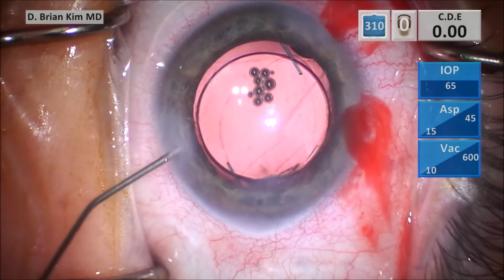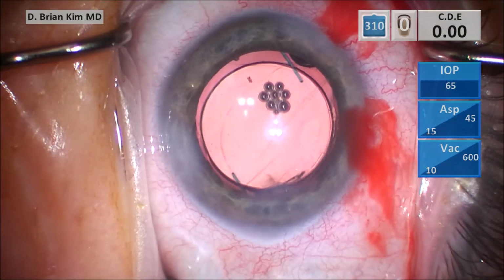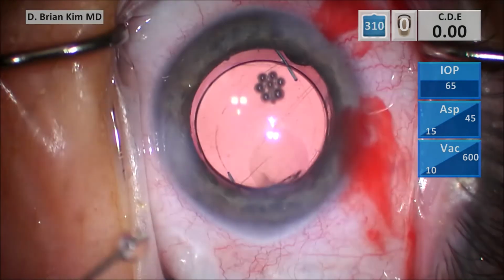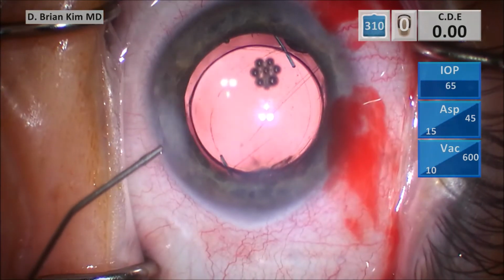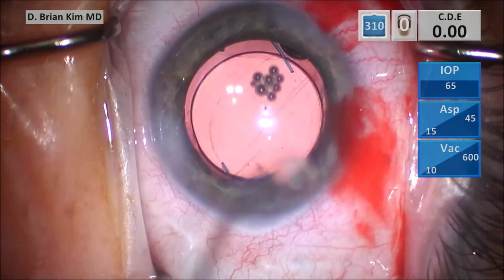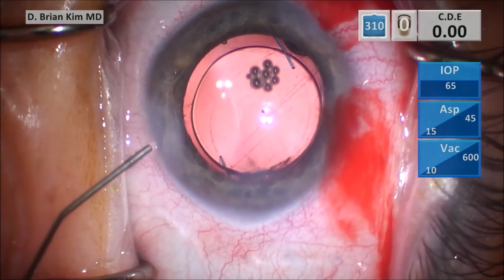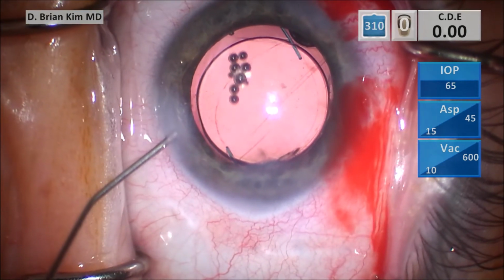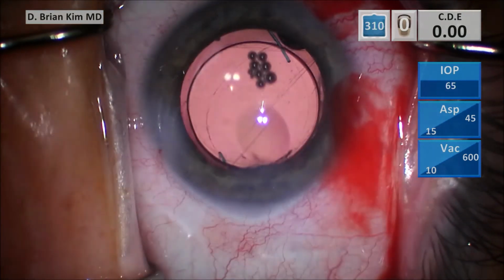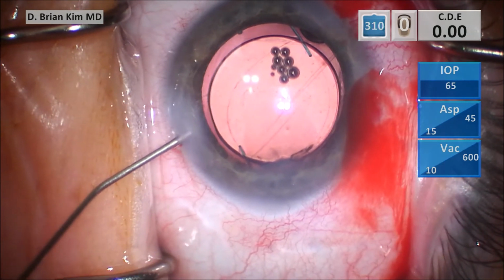I did tell the patient, because she did have some evidence of zonular weakness in that nasal area, that down the road she may need to have further surgery. And so she is prepared that she may need to have a Gore-Tex suture to the sclera. But in essence, in these difficult situations, you want to tell the patient you're putting the lens in a less than ideal situation. And so we're going to do the best we can to stabilize the lens, and hopefully it'll provide long-term stability.